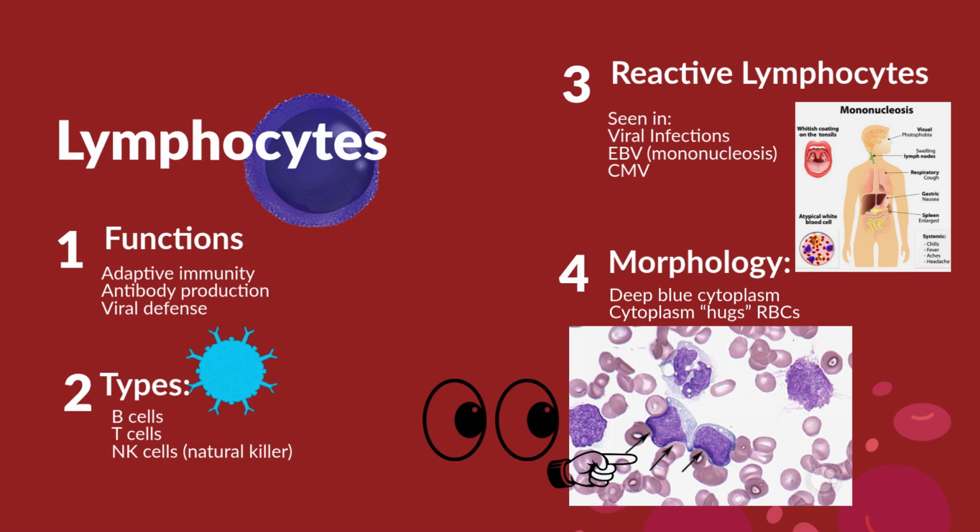And classic, I have some more pictures up here. You're going to see they have a classic look to them, and they really do. Lymphocytes are mostly nucleus, typically like the picture I have right behind the lymphocytes lettering here. The chromatin pattern is dense and clumped. This helps distinguish them from blasts. These are not blasts, okay?